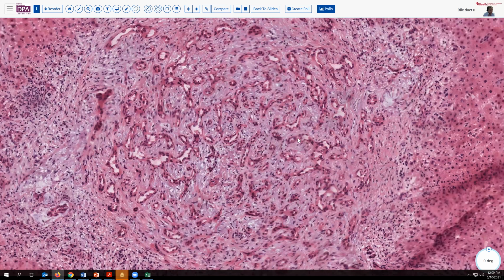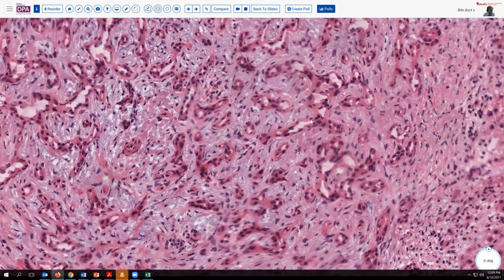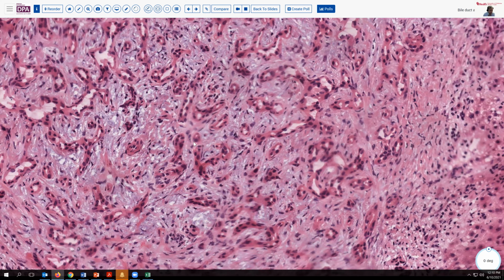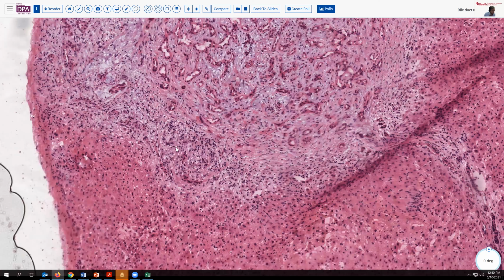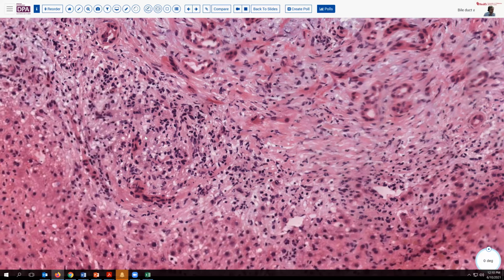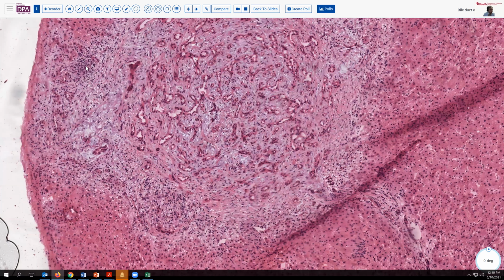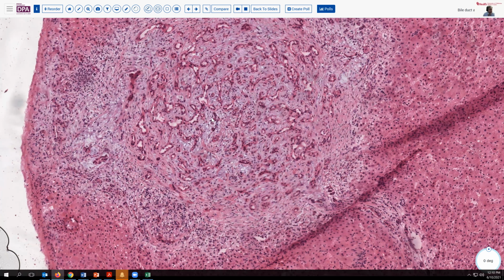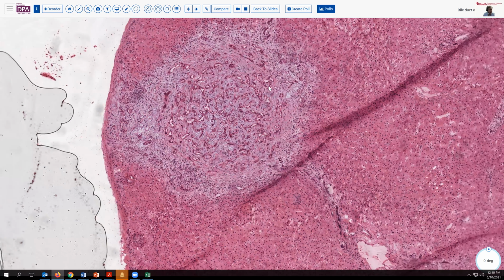As you look at this here, you see there's a little bit of low-grade atypia to some of these cells, not very pronounced, but a little bit of heterogeneity. But the clue is here: you've got this little peripheral rim of inflammation. And you shouldn't see that in the typical desmoplastic metastasis, or at least not to quite the same degree on the normal liver side of things. Again, rounded contours are more common than wedge-shaped, although they can be slightly irregular.